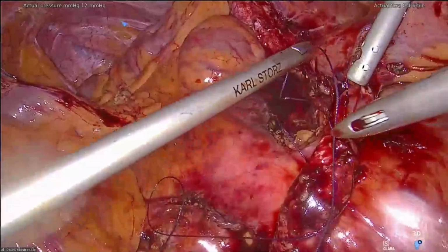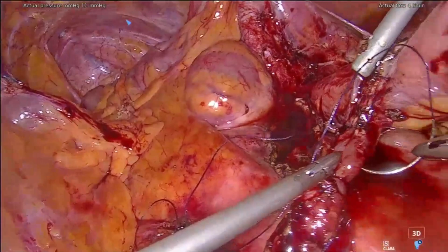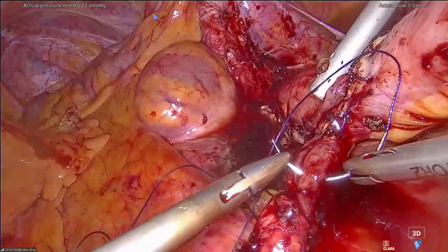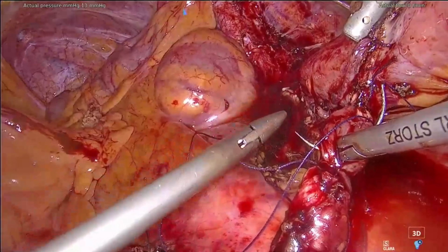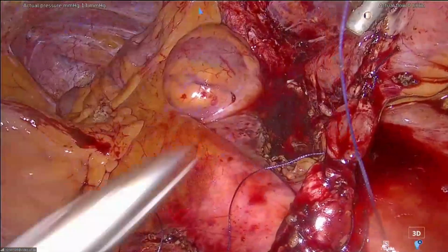It's okay, it's a good caliber, because we have a difference of diameters between the ureter and the Monti, because I really have to take the edge. If not, I will make a sausage. We have a pseudo difference of diameters, but it's due to the quality of the tissue. The bowel is smooth and the ureter is rigid. And for me, it's not a big problem.